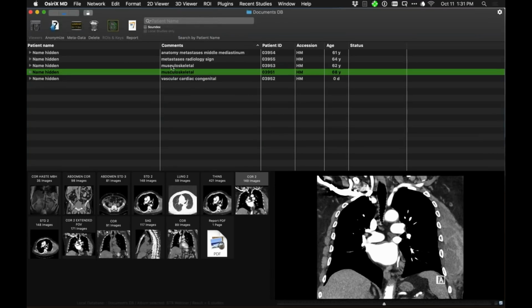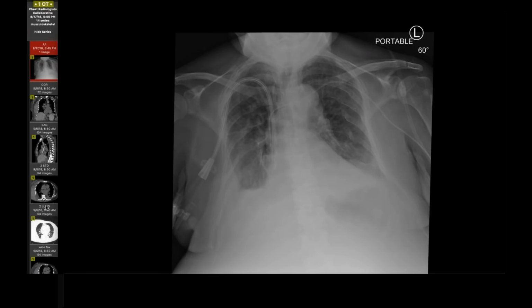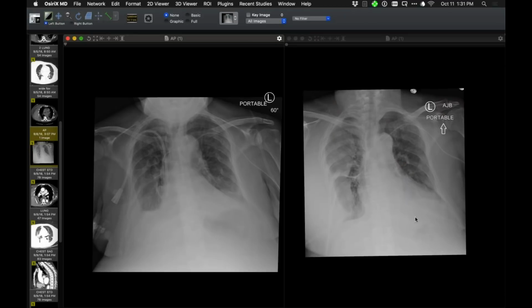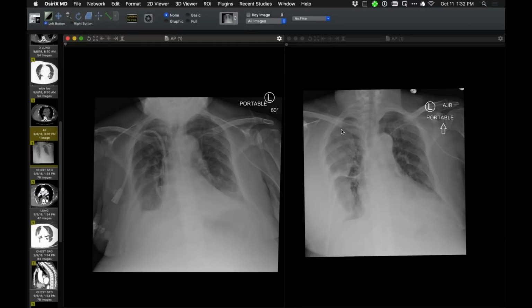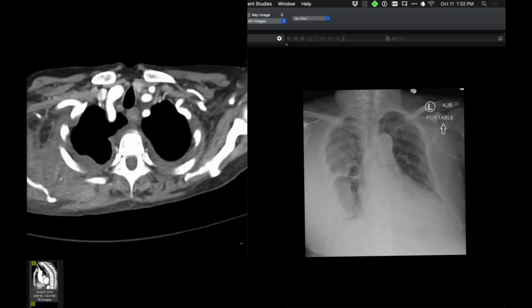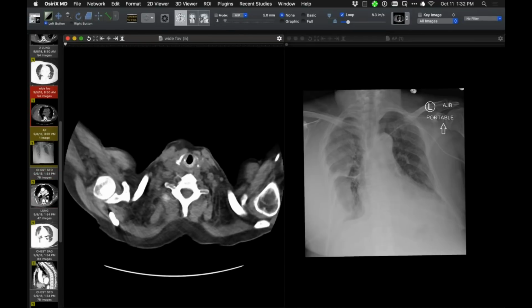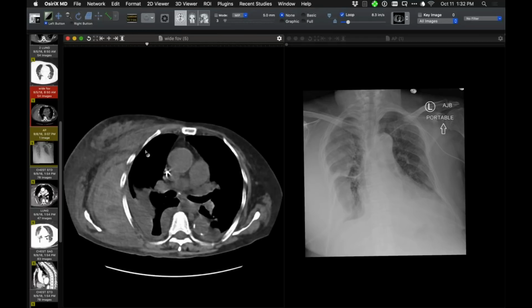And then last month, we had a very similar case to that, and it's this patient. So if you had a chest radiograph at the right time, the chest radiograph would look something like this alongside. And you'll see this very large, extensive opacity in the right hemithorax. You can appreciate that there is a lot of chest wall abnormality associated with it. There is an interface here consistent with a pleural and or extrapleural process. Of course, that extrapleural process is this very large hematoma that you can see there. And I think I have a bigger image showing it a bit more. So very typical features of a huge hematoma with a lot of hemoglobin in it, as you can see there.